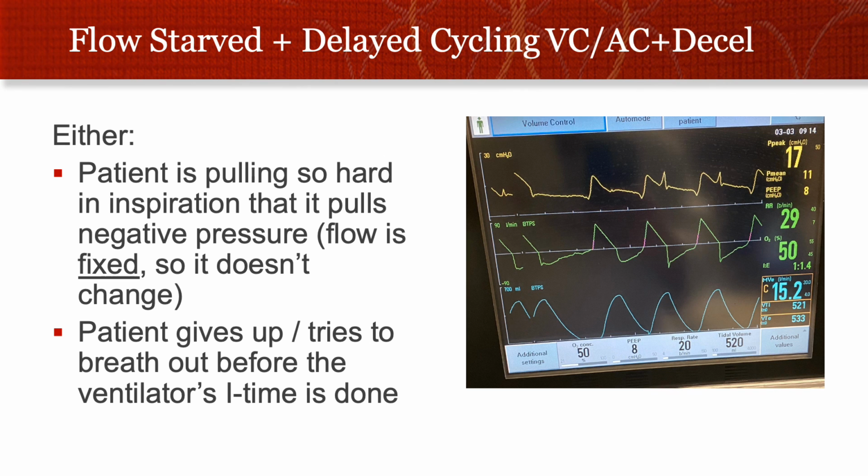But here we see again that flow starvation pattern, and then the patient seems to give up at the tail end of the breath. And so maybe the inspiratory time is too long.